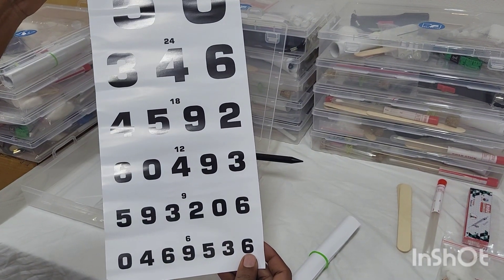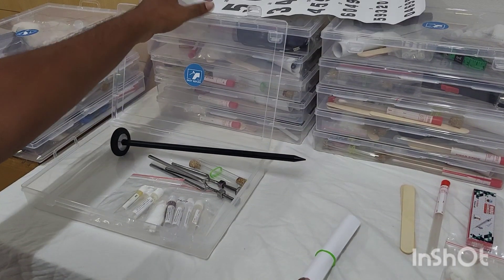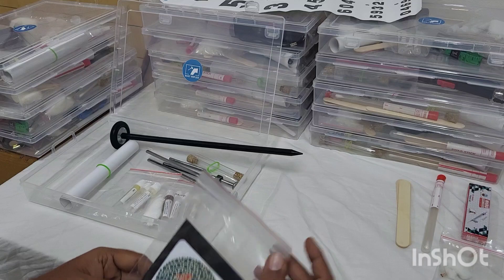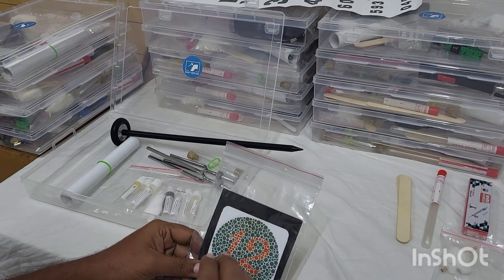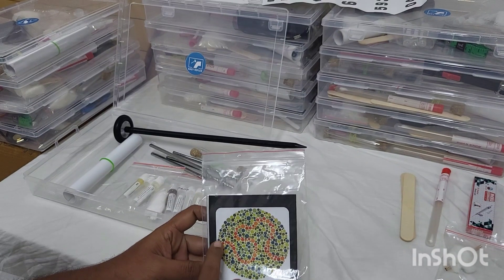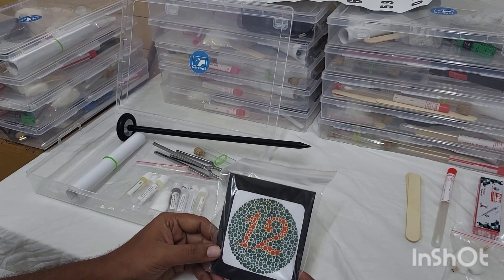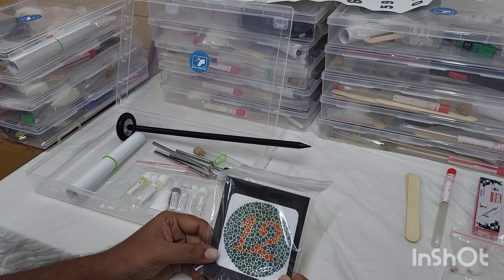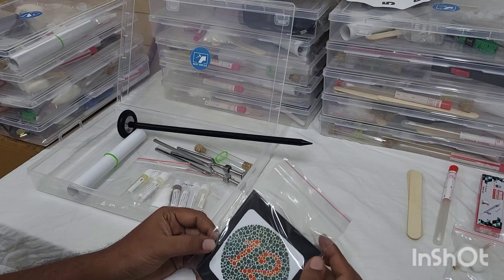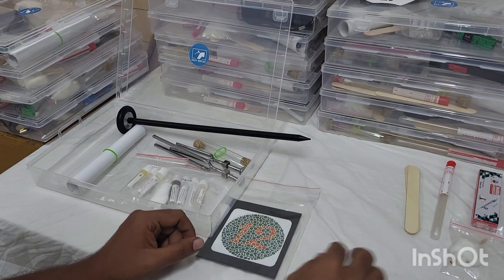Next you have your Snellen chart. We have the numbered chart so that it is useful for both literate and illiterate patients. We have rolled it and kept it in the CNS kit. Next we have your Ishihara chart, both for educated and uneducated patients — for educated patients there is a number, and for uneducated patients you can use the tracing. We have given 12 Ishihara plates in this cover so you can test the second cranial nerve color testing with 12 different plates.